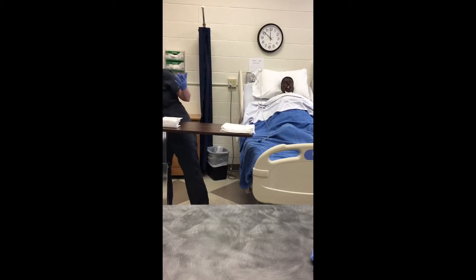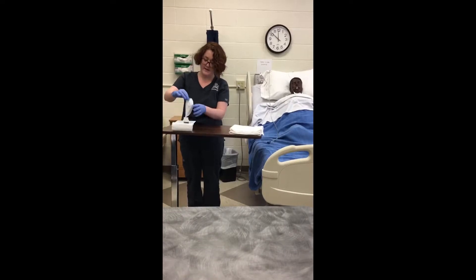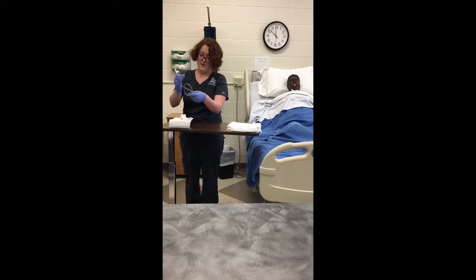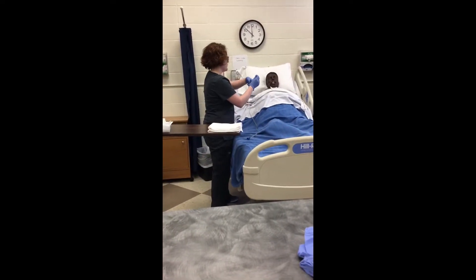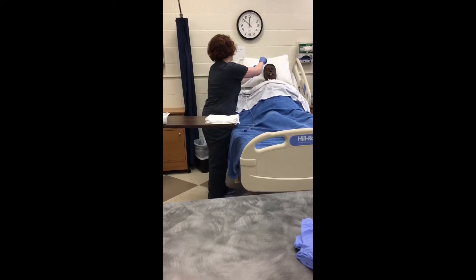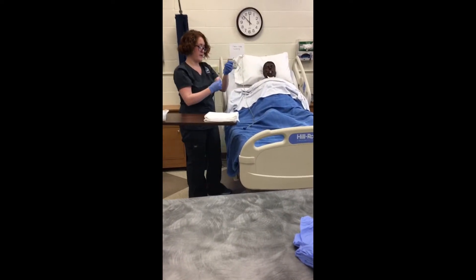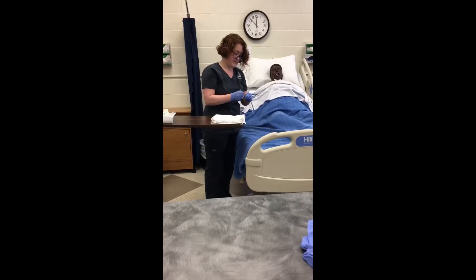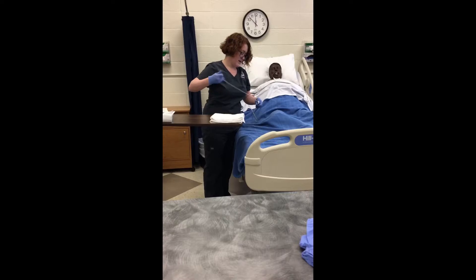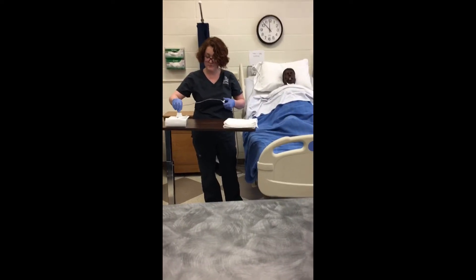Then I'm going to move this out of my way and prepare my kit — opening up my lubricant and getting my catheter out. I'm going to measure from the nose to the ear, mark it, and then from the ear down to the neck. Now I'm going to gather it up in my dominant hand and use my non-dominant hand — breaking sterility just with this hand — to connect it. I'll occlude this, make sure it's working properly, and aspirate a little bit of the fluid to double check. Then I'll lubricate the tip.